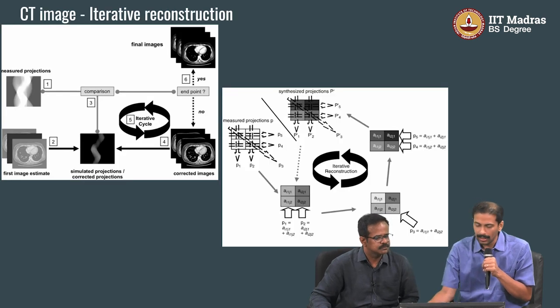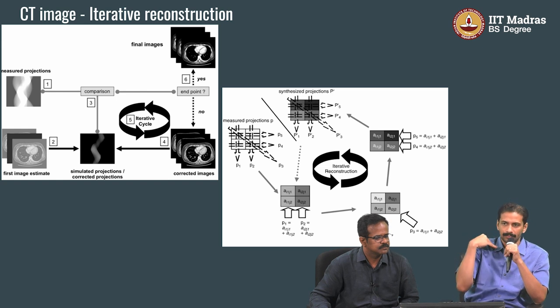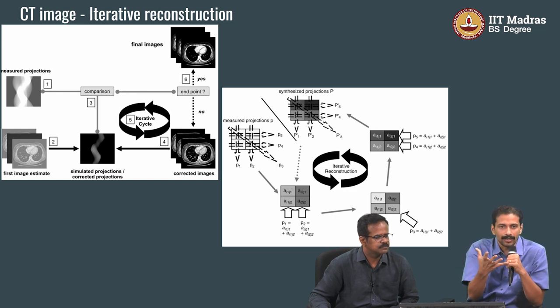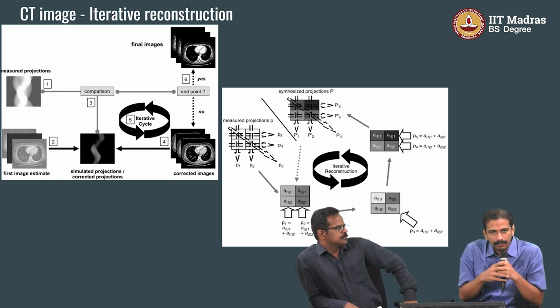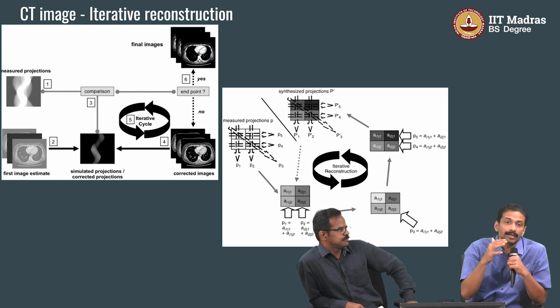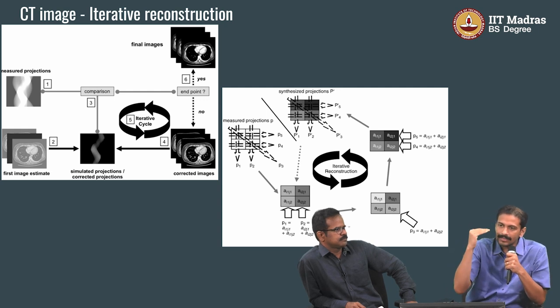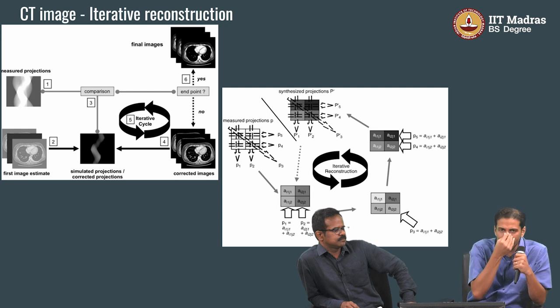Okay. So now once you acquire the entire volume of data, the job is to make slices. Because we cannot interpret the raw volume data, it has to be sectioned at our predetermined locations, right? That process is called reconstruction. Once you have the entire data, creating sections is called reconstruction, right? There are multiple methods of reconstruction.